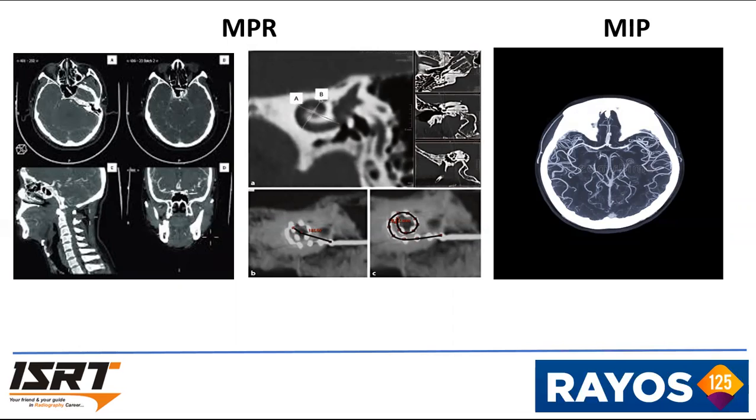That is why it is called transaxial scan or CAT scan. Earlier, and today also, we are acquiring in the axial plane, but we can reformat. On the earlier machines or systems, we didn't have the software to reconstruct the image in multiple planes.